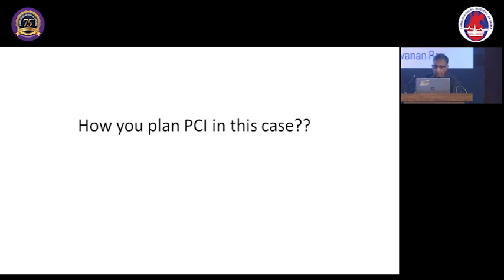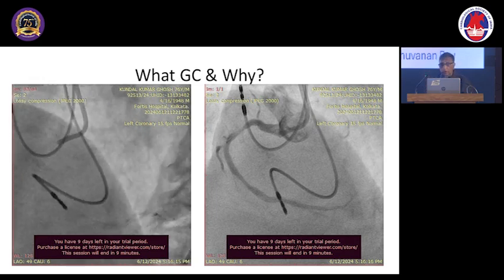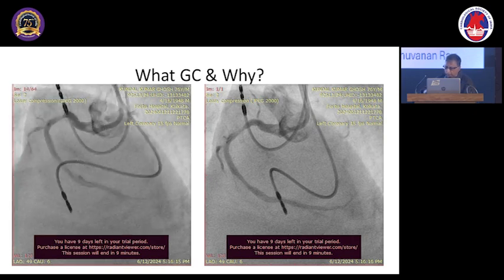So we did a stenting, and there was a lot of slow flow, and it is not a perfect job. So I was mistaken. Basically, the need of the hour is to balloon dilate, perhaps with a cutting balloon, and establish the flow, because a stent is not needed here. So this is the management protocol, so I'm not going into it. It's a lot of theory. You can see in that picture the references I've given.